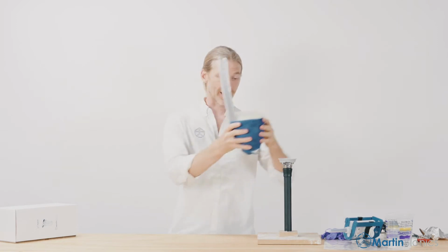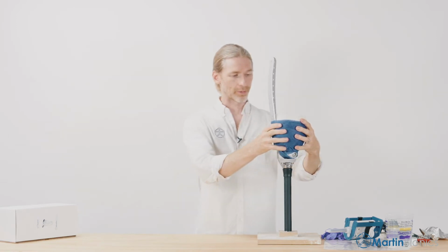So I'm first just going to gunk this in place, use some FabTech glue, find the right flexion and adduction angle, and then just gunk this in place. I'll wrap the gray plate in, and then this will be stout enough to go ahead and assemble the components and try on the patient.